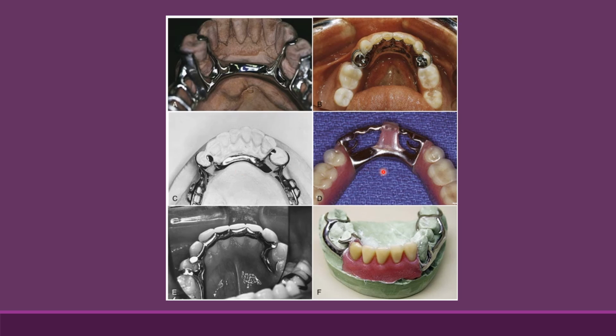Then you have this combination bar, also known as the lingual bar with cingulum bar. This is your lingual bar and this is your cingulum bar. Can you appreciate this part E of the picture? This is solely the cingulum bar. Now if you add the cingulum bar along with your lingual bar, below in this area, this becomes your combination bar, that is, lingual bar with cingulum bar. This is solely your cingulum bar.